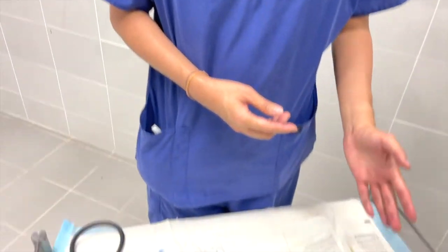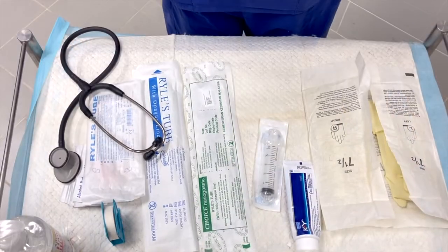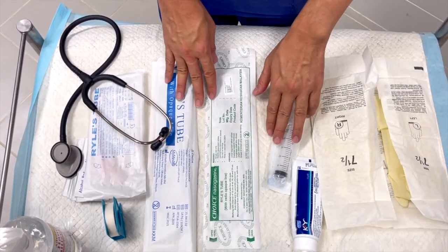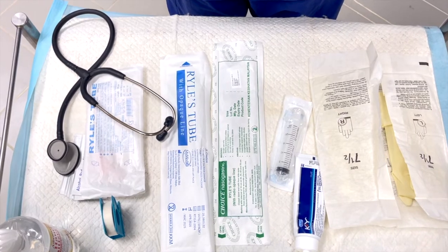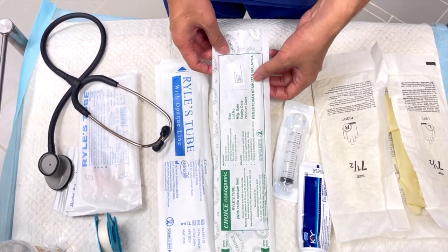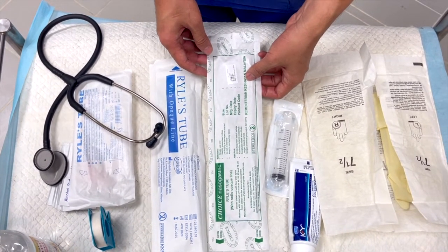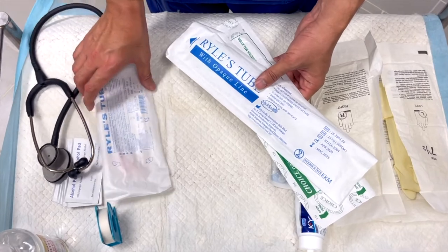Before we proceed with the nasogastric tube insertion, let me show you the equipment needed. Most importantly, we must have our gloves in an appropriate size, together with the appropriate size of the Ryles tube. There are many sizes available depending on the type of patient — adult or pediatric. For the adult population, we commonly use size 14 or 16 French, depending on the body size of the patient.